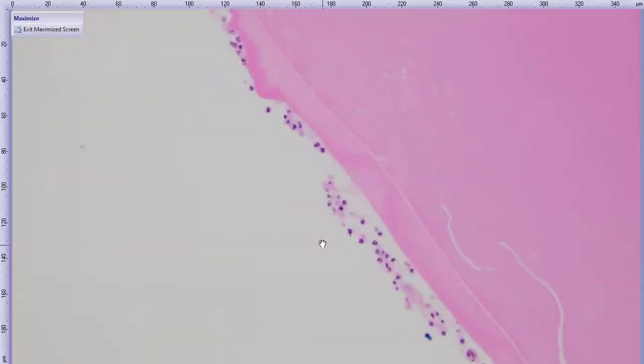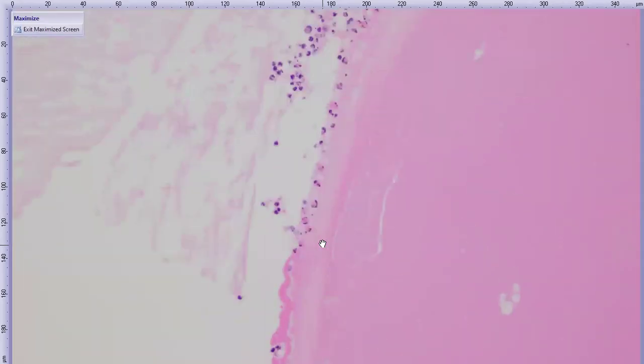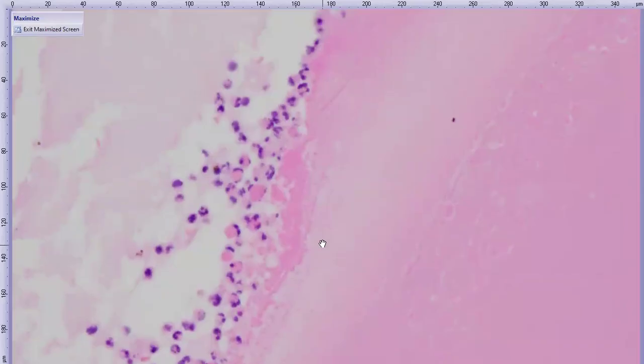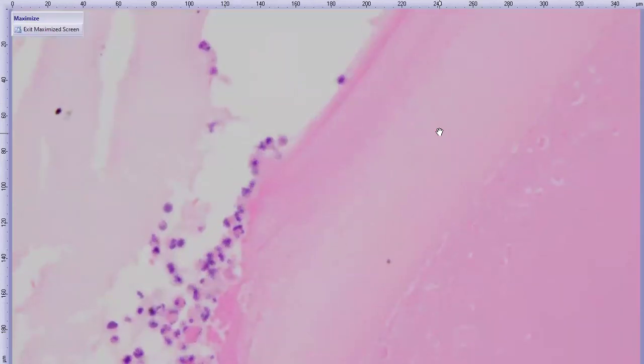A really interesting feature of this case that we don't see all the time is that as we walk along this lens capsule, on top of seeing the protein bulging out like this as a solar flare effect. Wait, we're going to find it. I like likening it to a solar flare just because. All right. The lens is kind of weirdly sectioned, so it's hard to find exactly where everything is oriented. But here, for example, we can see that the lens capsule itself is frayed. And the inflammatory cells are lining that frayed edge and phagocytizing lens protein again. The capsule itself also has a really unusual look here. It's got this stippled, more brightly eosinophilic stain through it, which is kind of unusual.